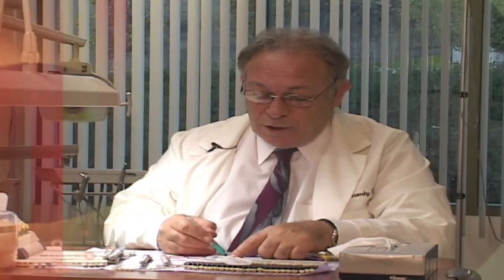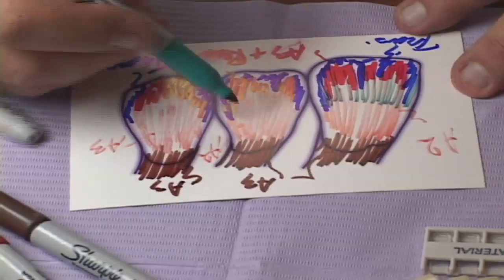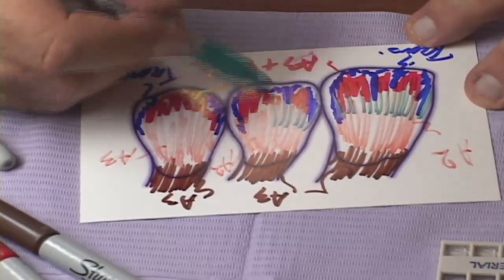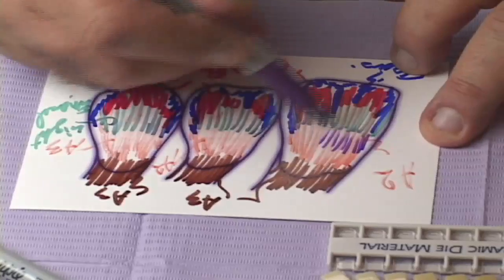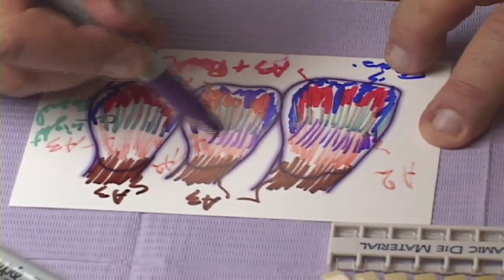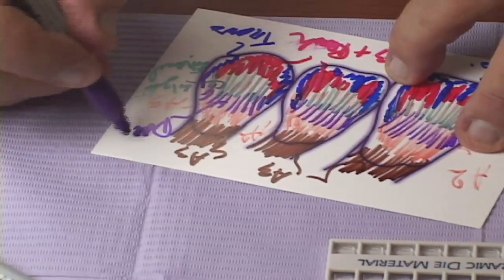The next thing to establish is the enamel color and how much of the enamel is covering the tooth. In this situation, the enamel that is visible is covering approximately half of the tooth, and that will be marked with green. Green represents a lighter enamel. Now it could be that we have a little bit more of a gray zone of enamel, and we use the purple pen to describe that part. The gray zone of enamel is in the middle third of the tooth and represents dark enamel.